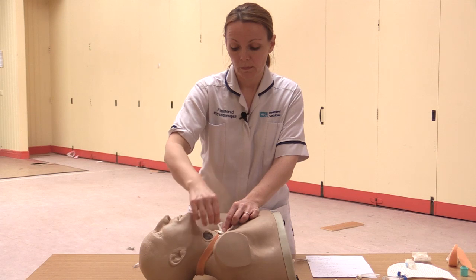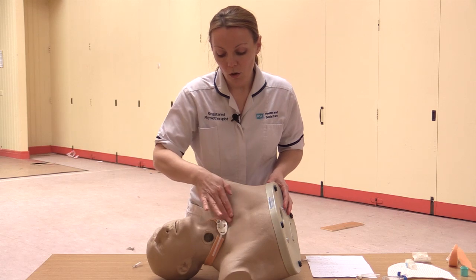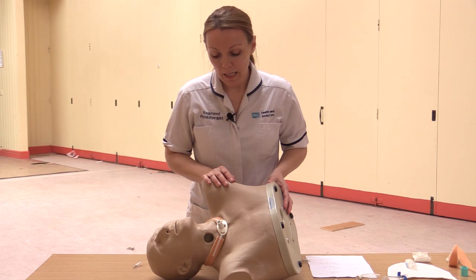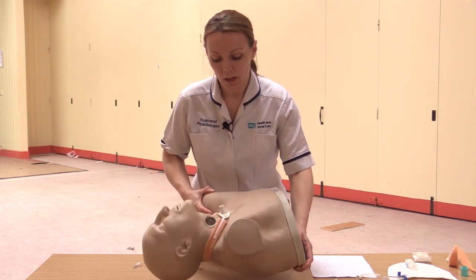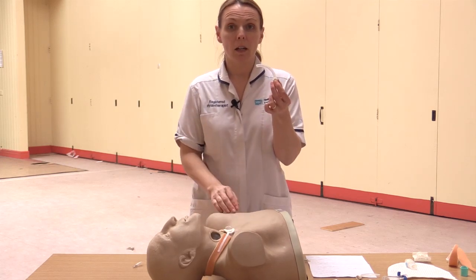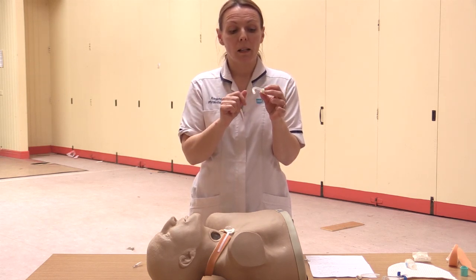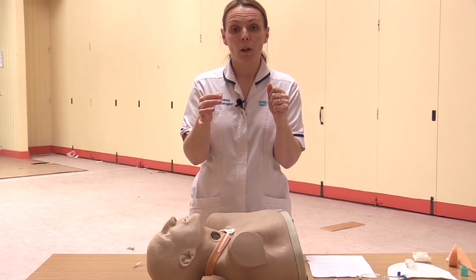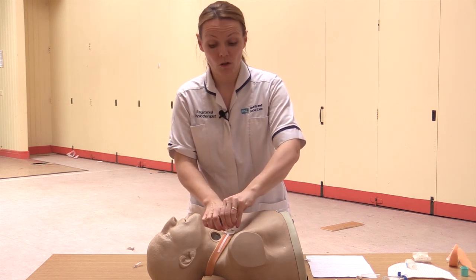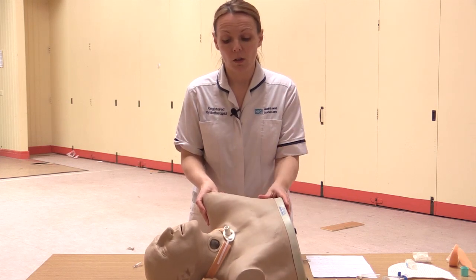Okay. It's important that you keep the area around the stoma clean and dry as well, and the skin is well maintained. And the other thing is the inner tube needs to be checked regularly, that there's no crusts forming in it, or no secretions that are blocking the tube. In the community, this would just be cleaned with warm soapy water and then rinsed with water and then reinserted. And the family would always have extra tubes, if they were very crusted or very difficult to clean, that they could discard and put a new inner tube in.